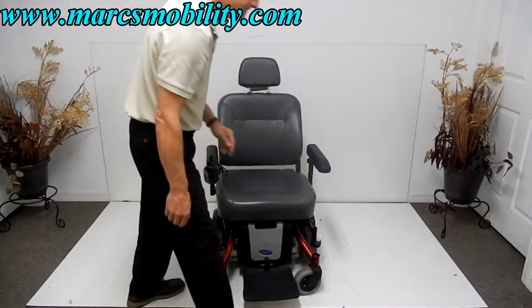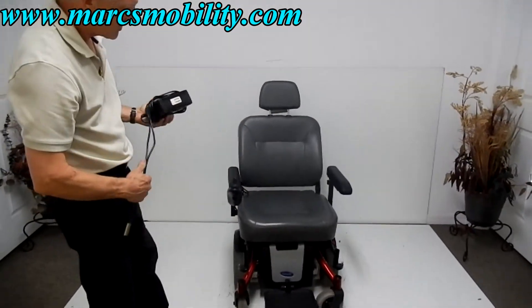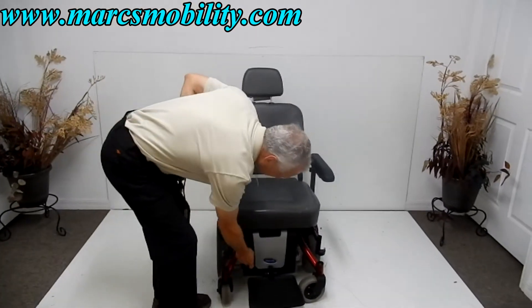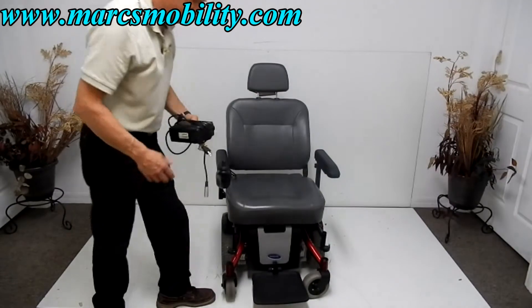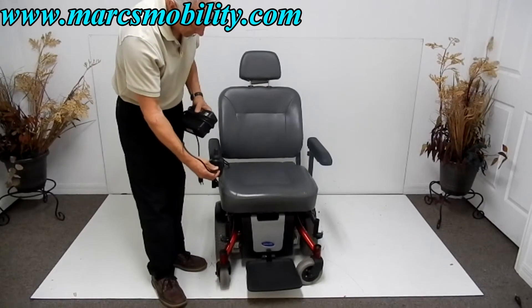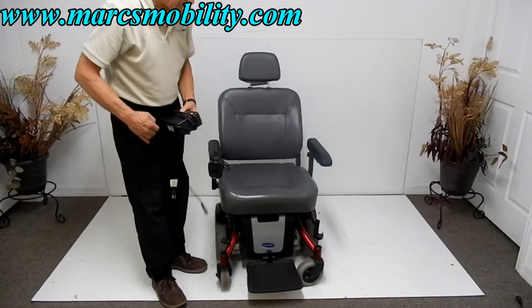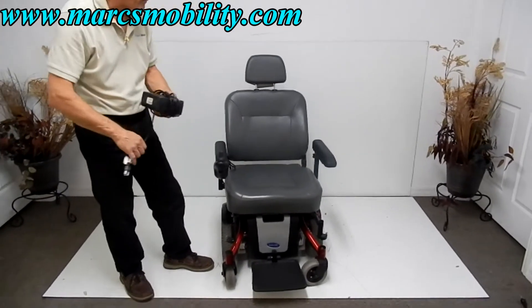It has an adjustable headrest. This chair does have two Group 22 batteries. On these Invacare chairs, they come out from the front — you have to take the screws out, raise the front, and the whole thing comes off. When you charge the chair, plug your charger right into the bottom of the joystick. As soon as the light turns green on your charger, you'll be fully charged. You don't have to worry about overcharging — the charger will stop charging automatically.